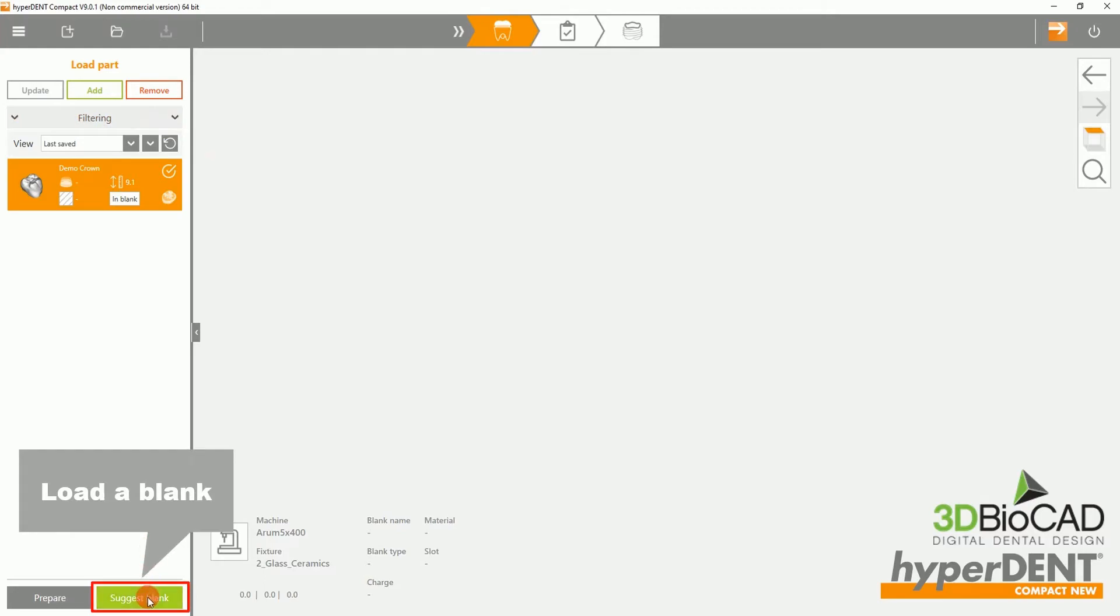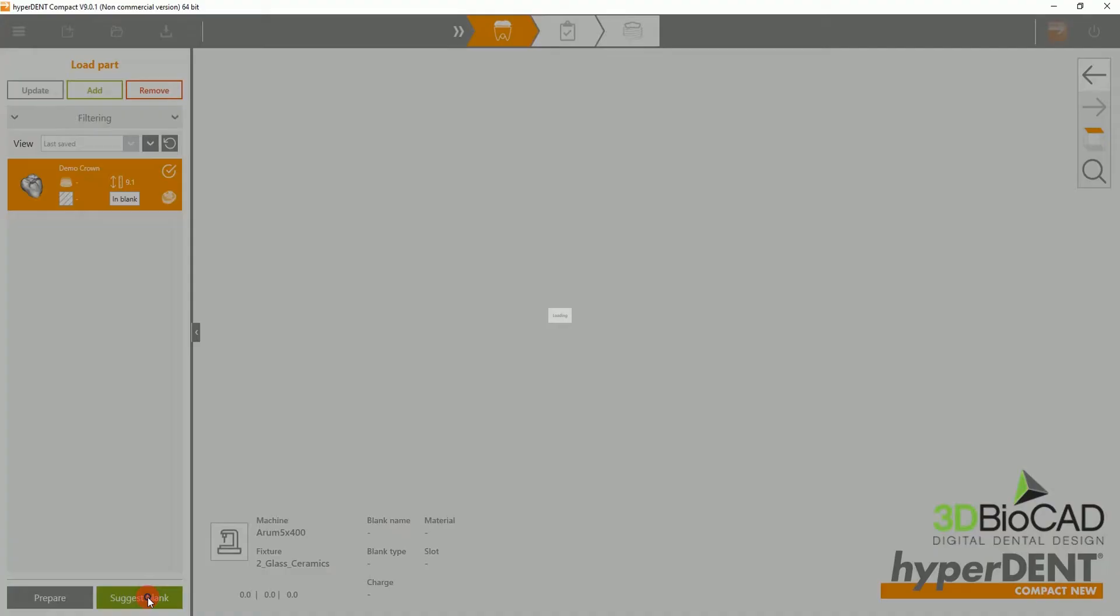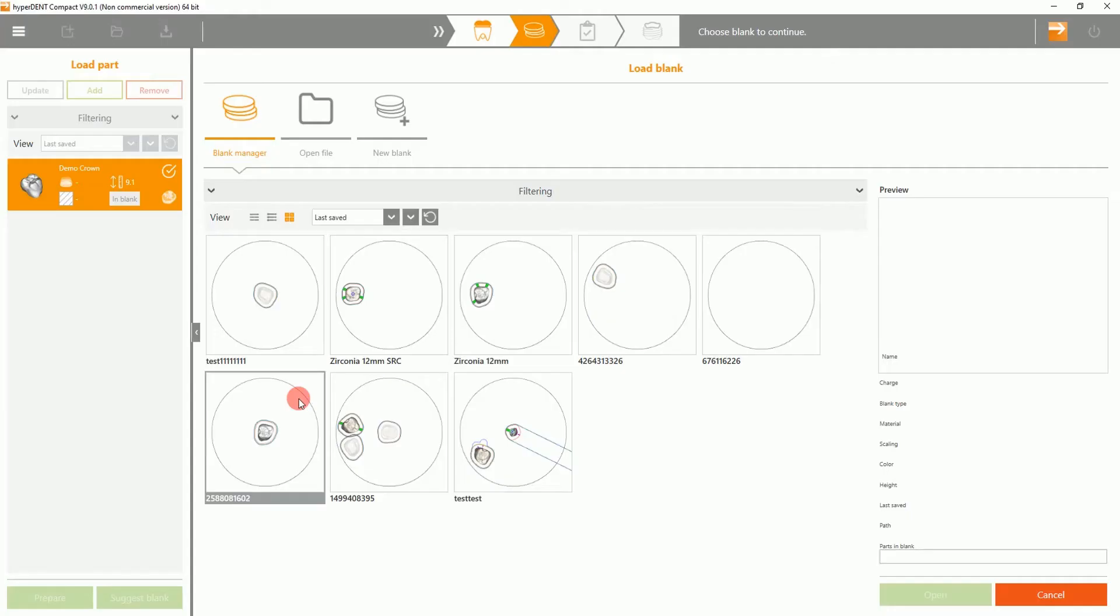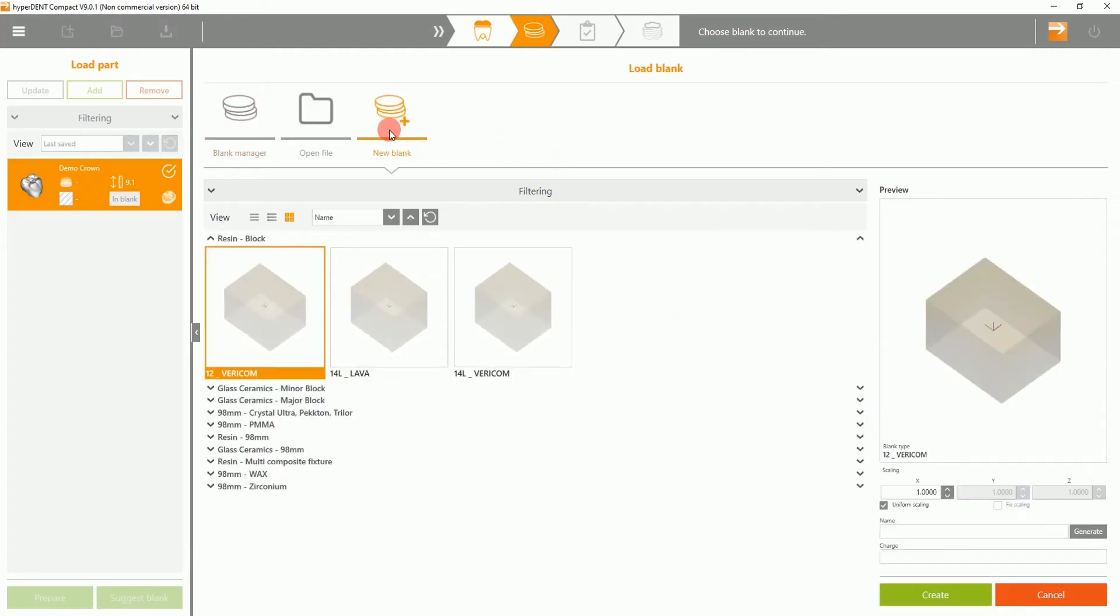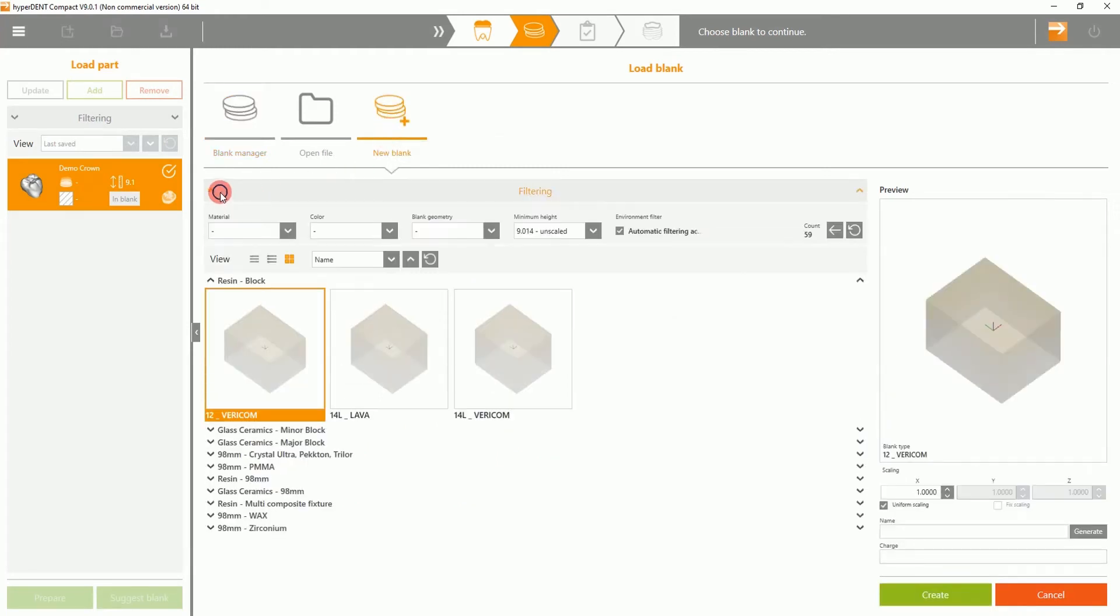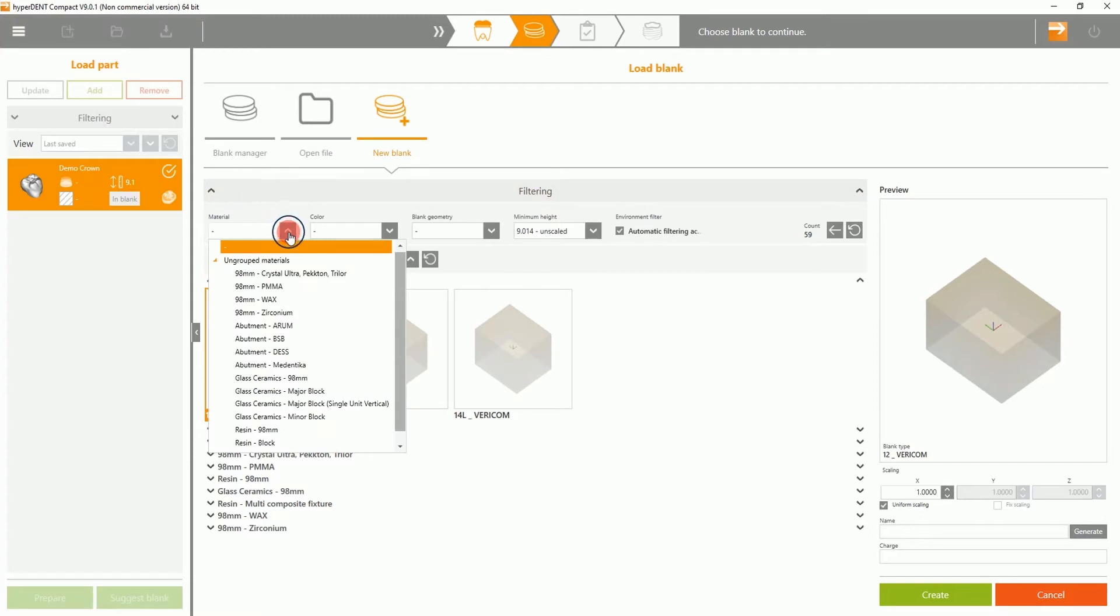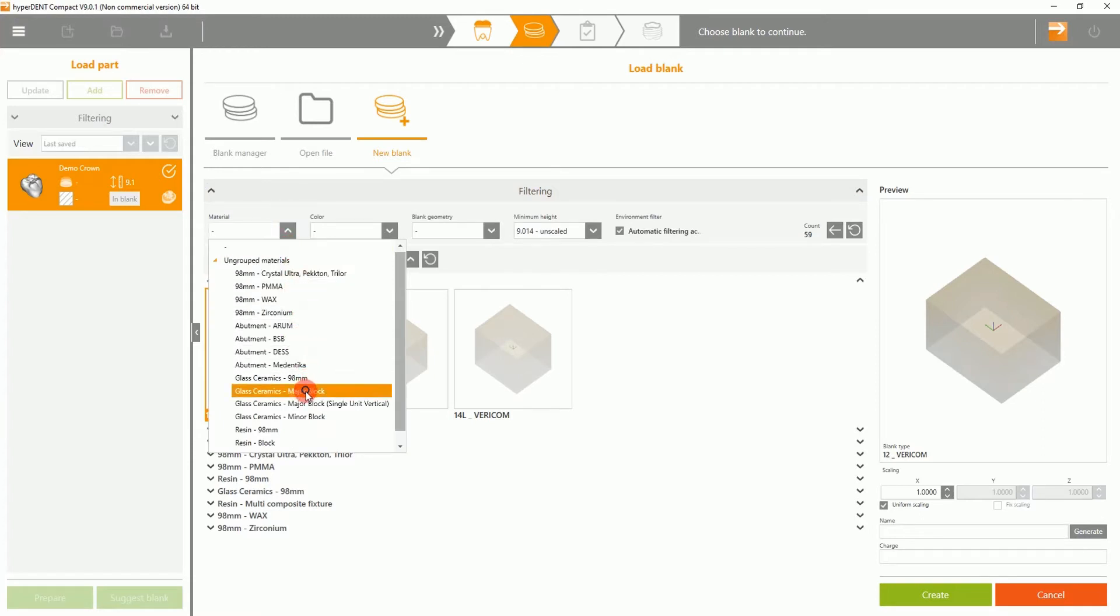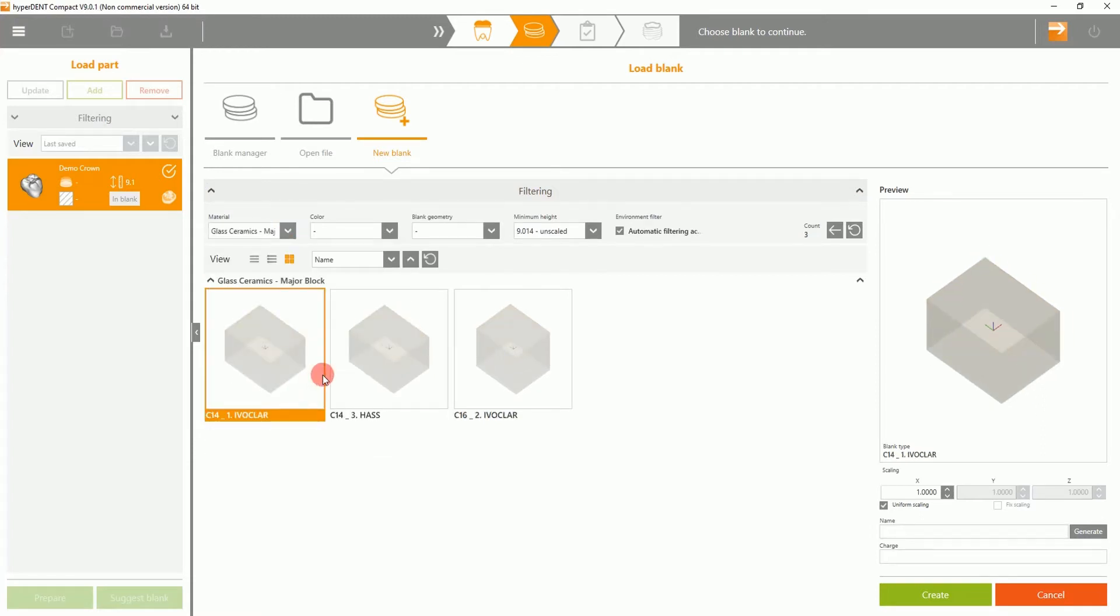Next, we'll want to load a blank. Here, we will be selecting a new blank. If you drop down filtering, you can select the material you desire to use. And underneath, you can select the sizing of the block. Then select create.